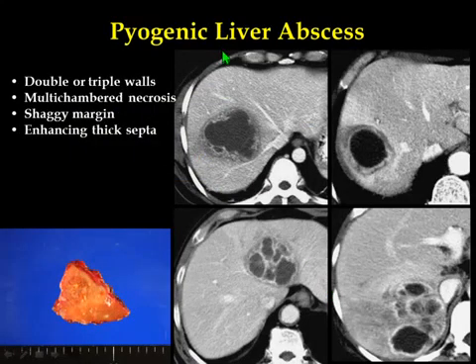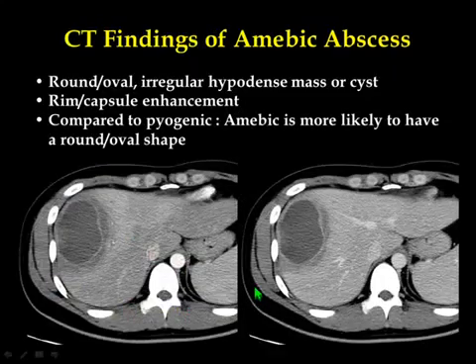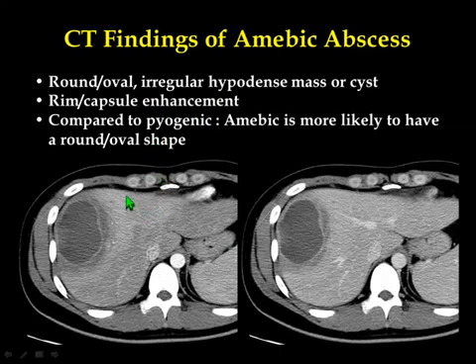What about liver abscess? Sometimes liver abscess looks like cysts, but in fact the wall consists of double or triple layers with multiple chambers. The margin is markedly irregular with enhancing septum. This is another case of amoebic abscess — fairly smooth, but with two layers and a cystic interior.